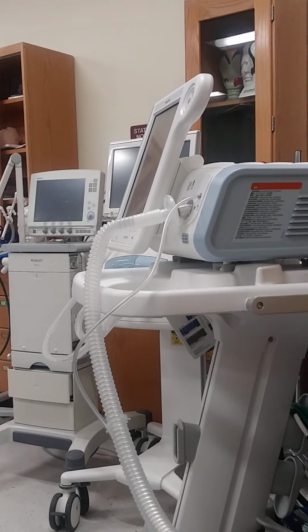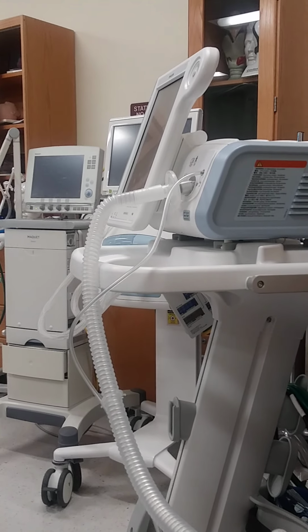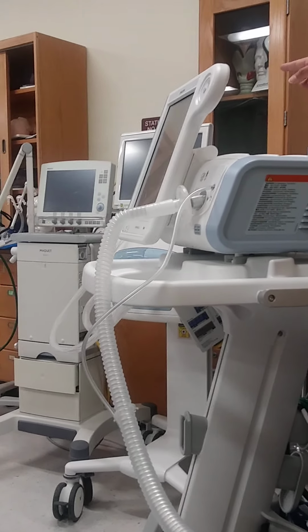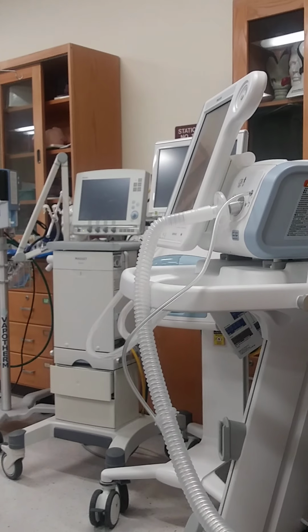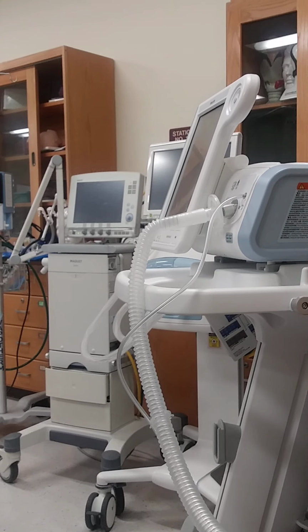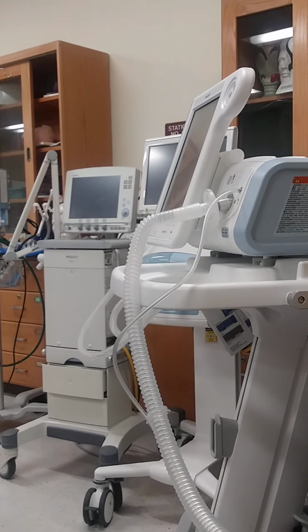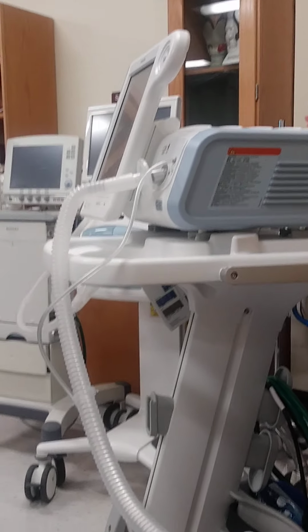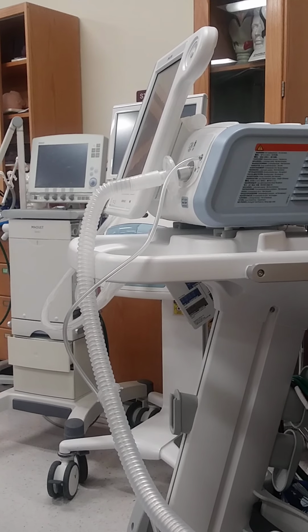Sometimes it doesn't. So when it doesn't, like let's say we put them on a non-rebreather or a Venturi mask and they're not getting better, and then we put them like on a high flow, remember the high flow device? Where it delivers a high level of FiO2 and then a higher flow, and they still have issues with work of breathing, then we have to think of non-invasive use of this machine right here, okay? So this machine, what it does is it provides a pressure and a volume to help supplement what they're not able to.